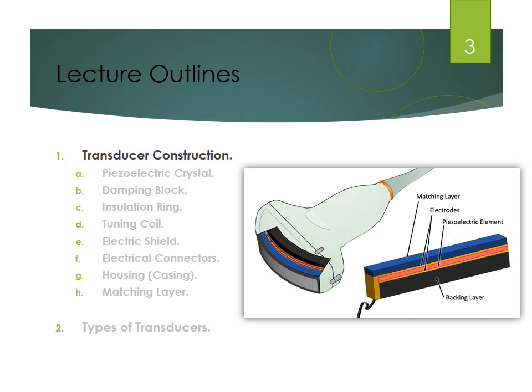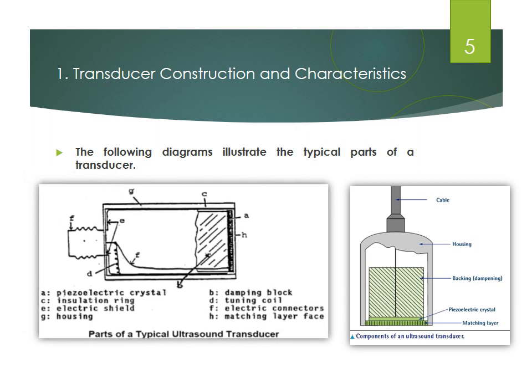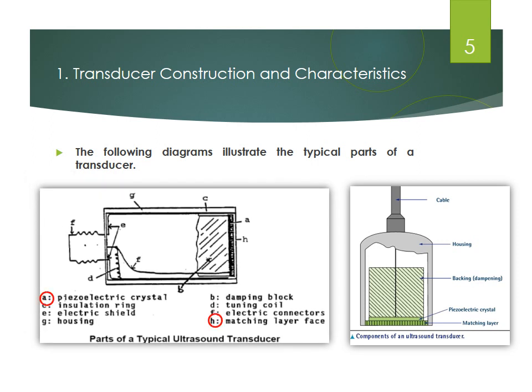Let us begin this lecture with a brief discussion of transducer construction. As you can see, the diagrams below depict the typical components of a transducer. As shown in the current slide, the basic components of each ultrasonic transducer were denoted by the letters A to H.